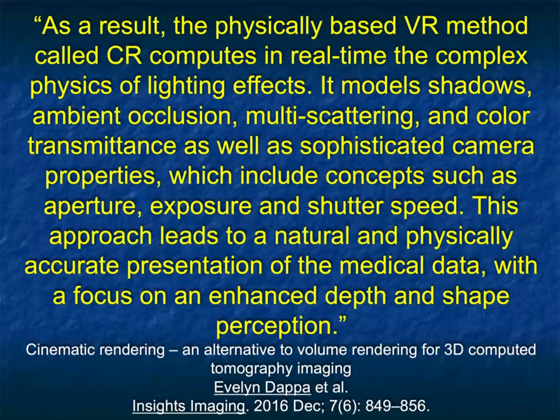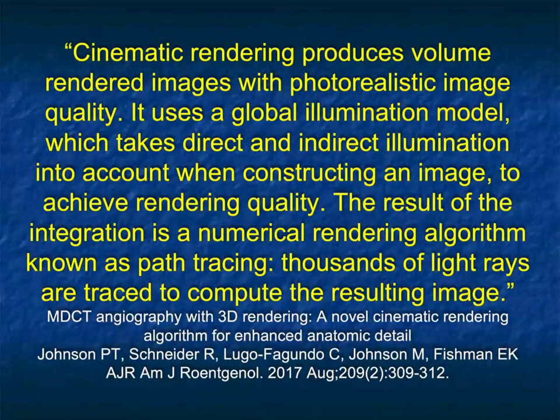The initial articles using this in practice were in Insights into Imaging. As a result, the physically based volume rendering method called cinematic rendering computes in real time the complex physics of lighting effects. It models shadows, ambient occlusion, multi-scattering, and color transmittance, as well as sophisticated camera properties. So again, this approach leads to a natural and physically accurate presentation of the medical data with a focus on enhanced depth and shape perception. Again, everything to us is accuracy.